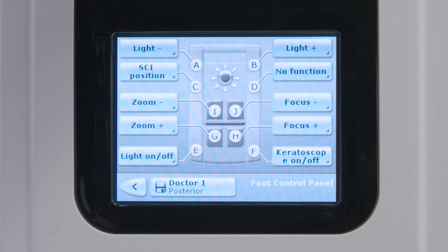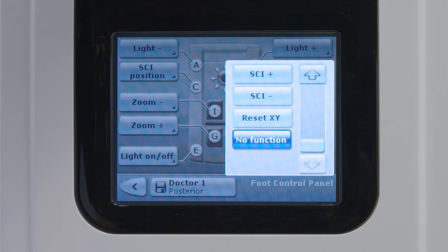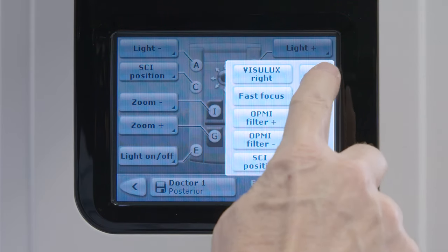Each switch has a number of programmable options to choose from. To change a programmed function, select the button pointing to the switch you want to change. A drop-down menu will appear. With the up-down arrows, scroll and select the new function you want.